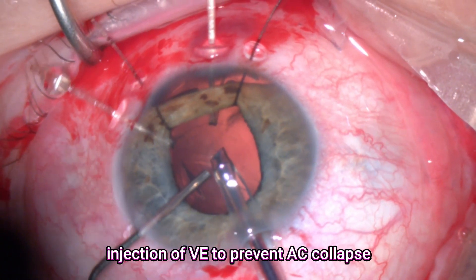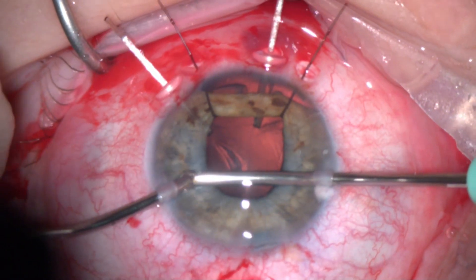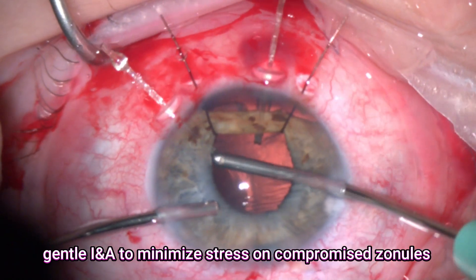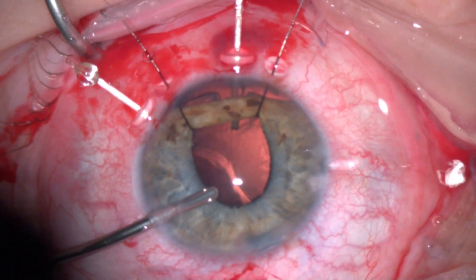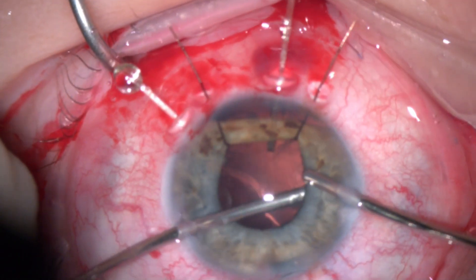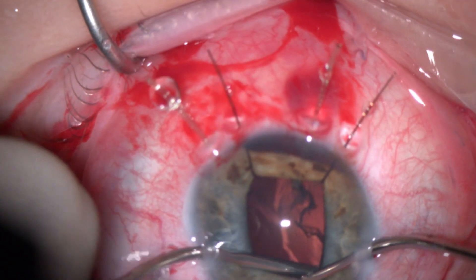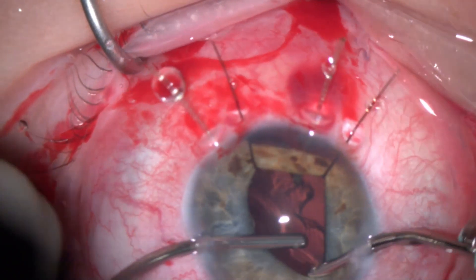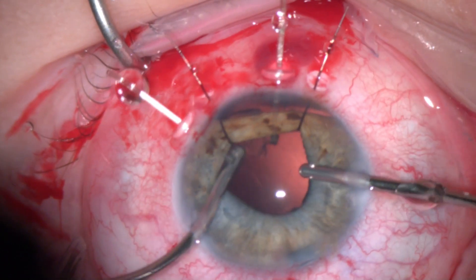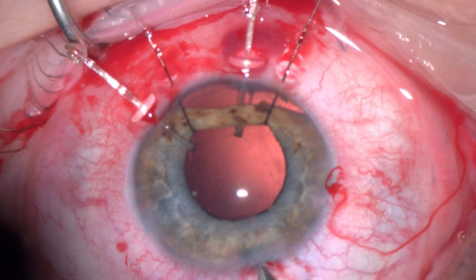After completion I injected some viscoelastic just to prevent the collapse of the capsular bag complex. This was followed by bimanual irrigation aspiration. Again, try to be gentle as much as possible because we expect there is a large area of zonular weakness. I often inject further viscoelastic before changing the irrigation aspiration, and just take your time in this step to remove it as much as you can. Fortunately we were able to remove all the cortical fibers, then again injecting viscoelastic before coming out.